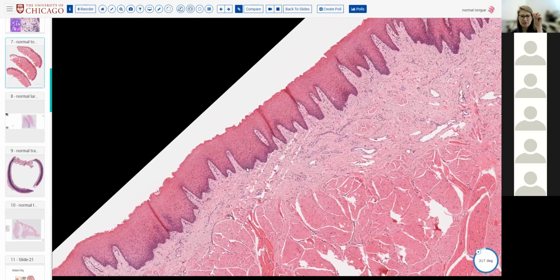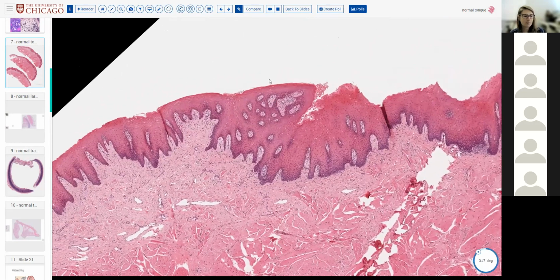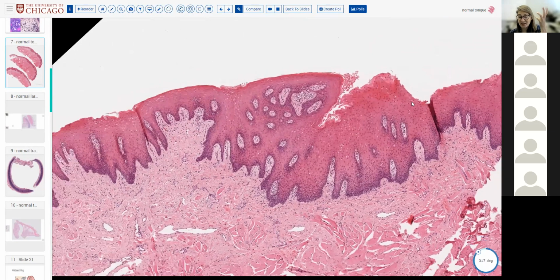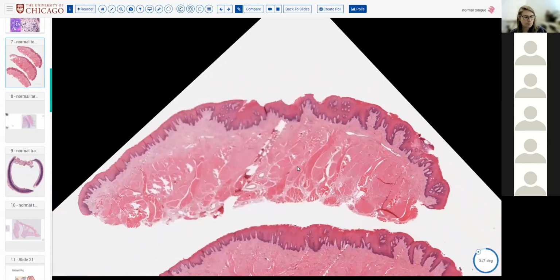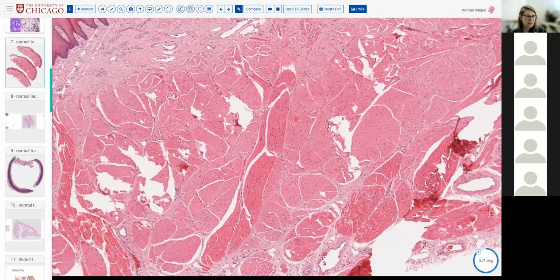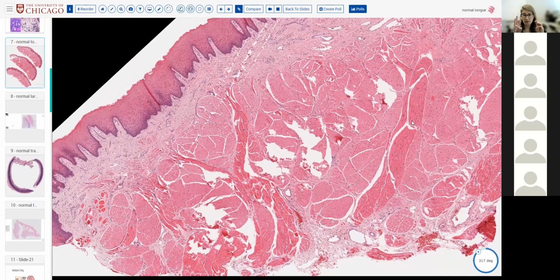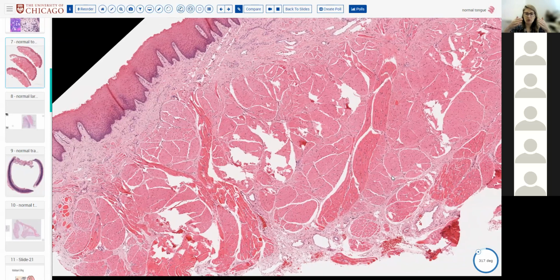In this case, it has a little bit of downward pointing rete. That's okay. You remember you do have taste buds and other structures in the tongue. So if there's a little bit of papillated areas, that can be normal if you're in a taste bud rich area. And tongue has skeletal muscle bundles underneath it. Remember that actually run in 3 directions. Okay, so the muscle bundles of the tongue are longitudinal, transverse, and basically vertical.